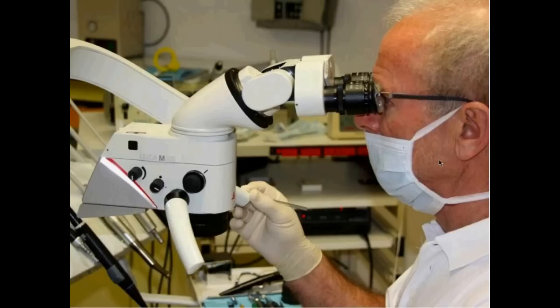The next interesting question, Mr. Fossdal, is: with a microscope and a rotating burr with water, the image on the microscope will be blurred. How do you cope with this water contamination? Well, the microscope will not be contaminated. It's too far away. I have no problems with that.